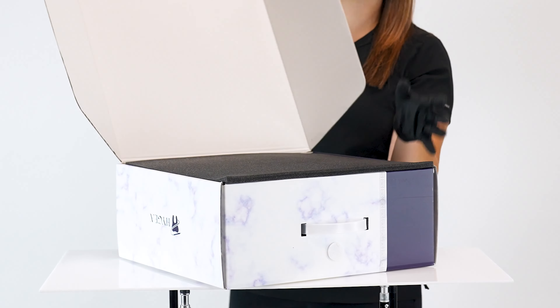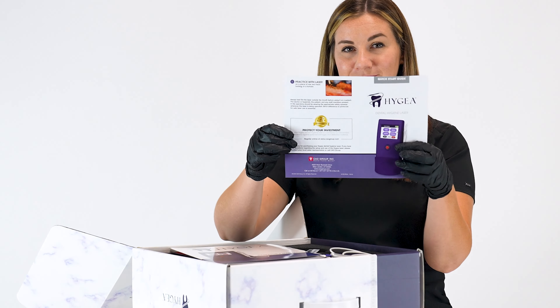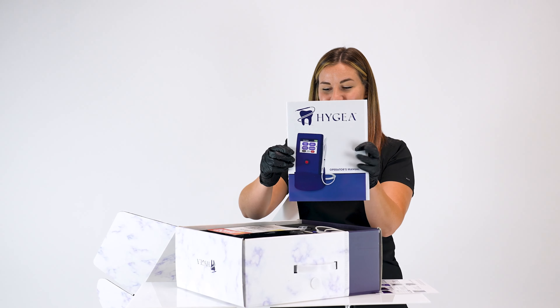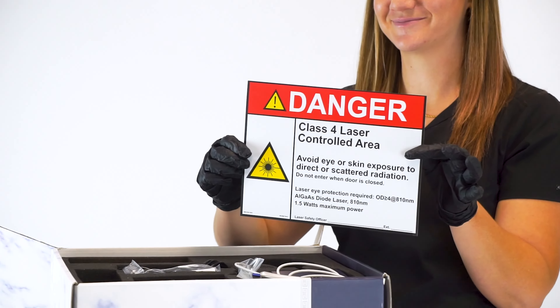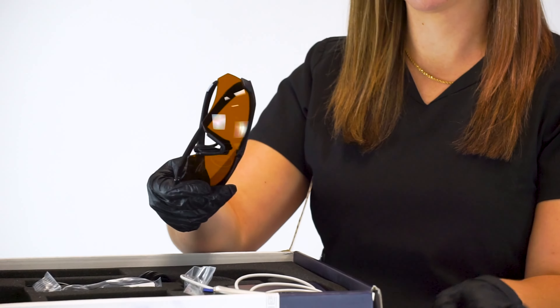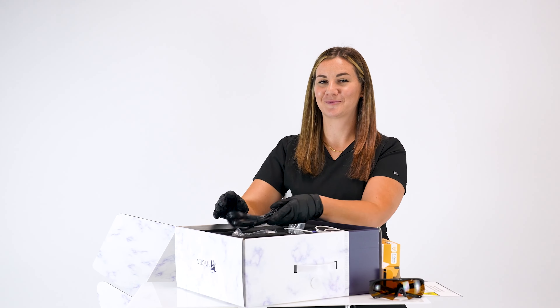Your new Hygeia diode laser comes with the following: one quick start guide, one owner's manual, one laser safety sign, two pairs of laser safety glasses, and one power cord.